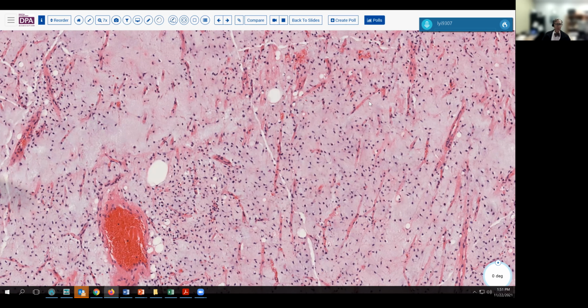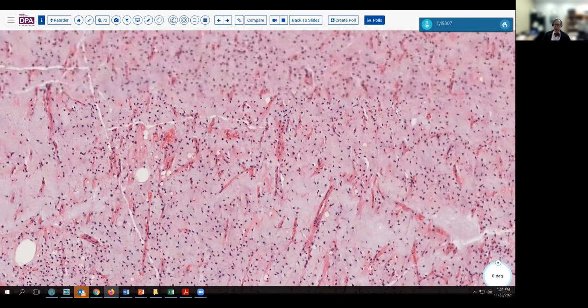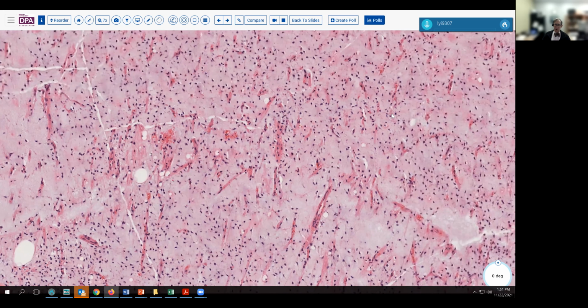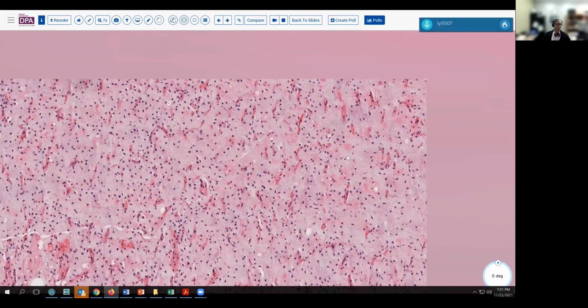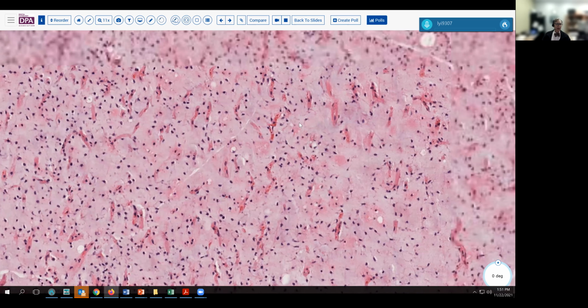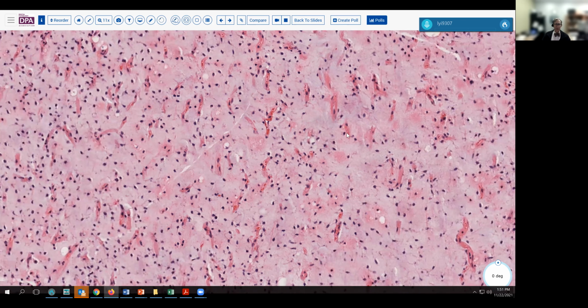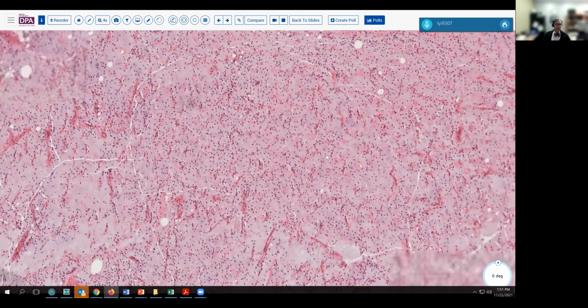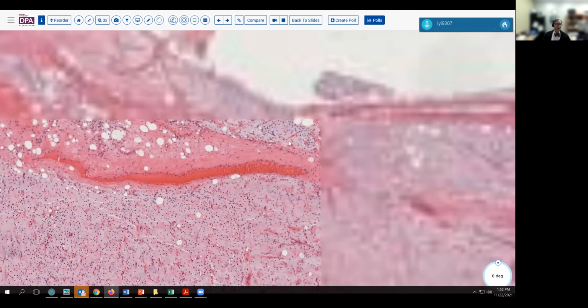Now, like low-grade fibromyxoid sarcoma, this tumor has a FUS translocation partner. So it's a T(12;16), whereas the low-grade fibromyxoid sarcoma was a T(7;16). It's the FUS gene on chromosome 16 that we're pairing with. And that is entirely diagnostic of a myxoid or round cell liposarcoma. The vasculature is quite characteristic, as I've mentioned, and can steer you certainly to the diagnosis.